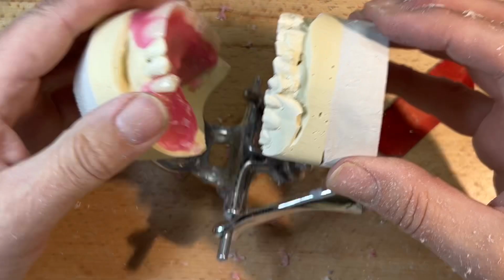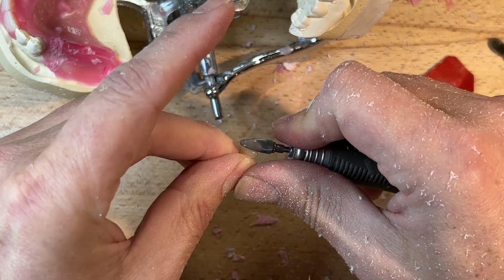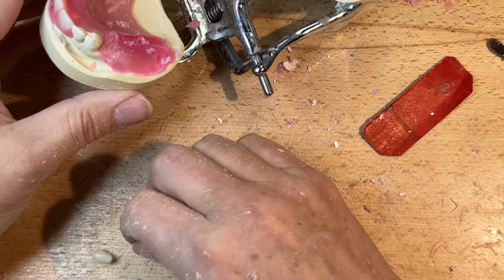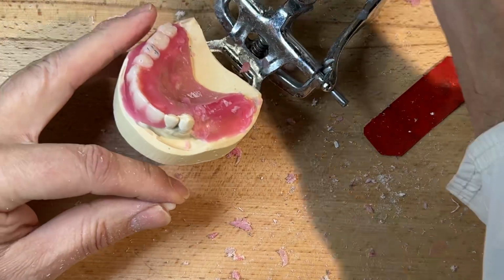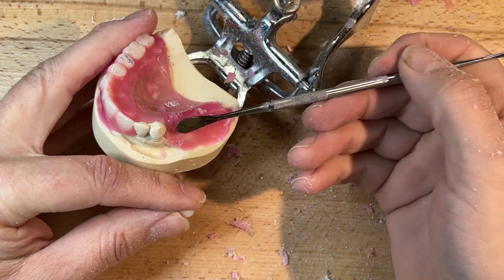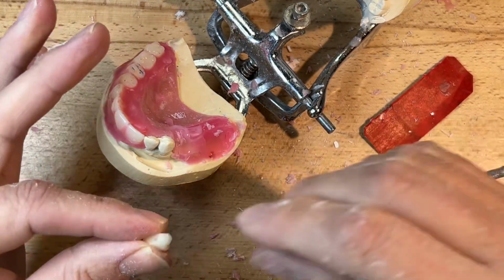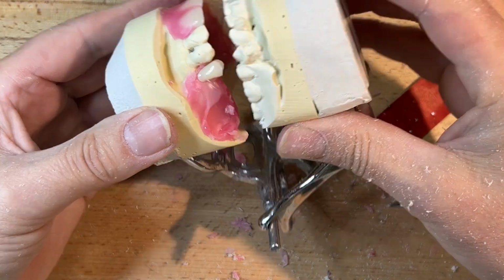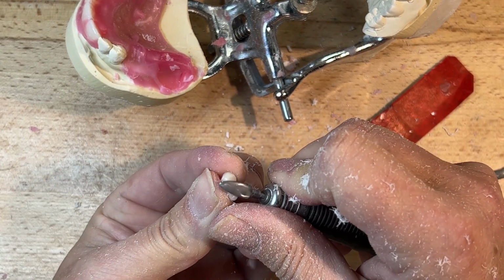Now I can mark it, or vicariously I can use my right eye, and oops. Stubbornly, I didn't soften it enough. I'm going to reduce the ridge lap still, but this is just for the occlusion first. And then now I'm going to reduce the ridge lap, and then I'll go back to occlusion, where I'm hitting the ridge.